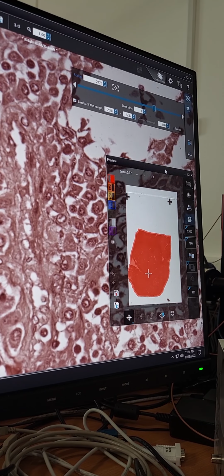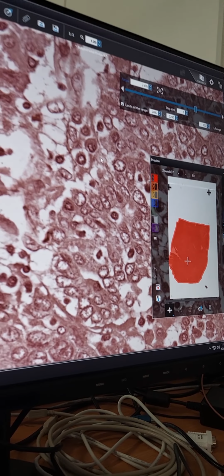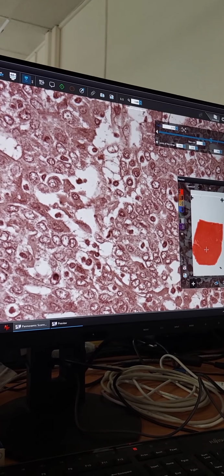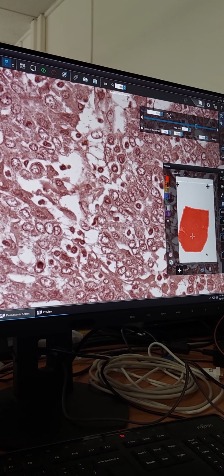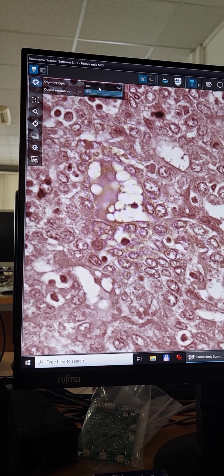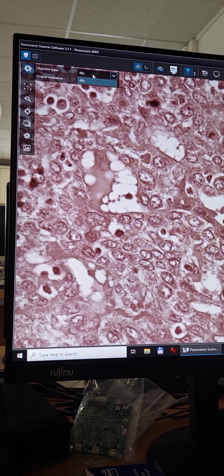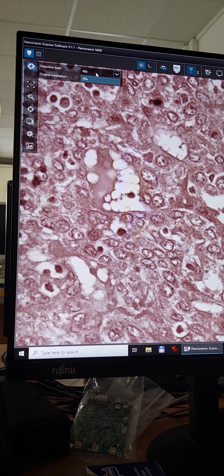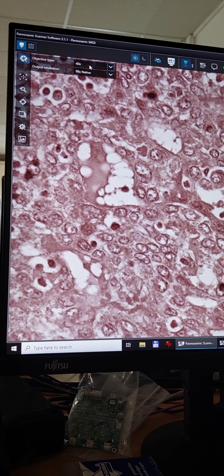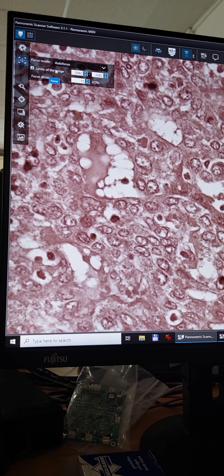Most of the time what you are going to see is the preview window and the focusing window, and that's it. So this is moving the sample, selecting the scanned area, and on the left side you can set the imaging parameter, what kind of objective I want to use. In this scanner now we only have one 40x objective. I think what you will get is going to contain a 40 and a 20x objective, so you can choose either. Here you can choose the autofocusing or the focusing method.